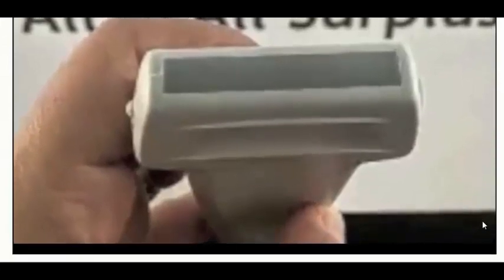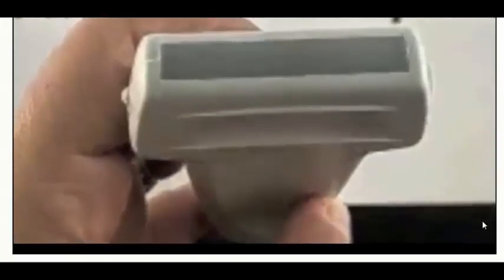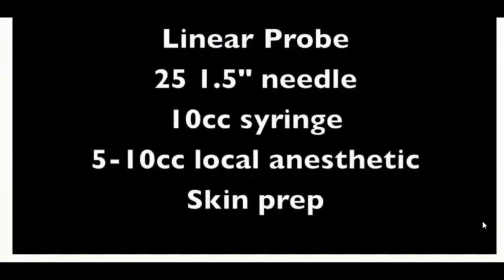The equipment required for this block includes an ultrasound machine with a linear or vascular probe. You should select a local anesthetic, usually either lidocaine or bupivacaine, based on the duration of anesthesia required. Grab the syringe, needle, and something to clean the skin, and you're ready to go.